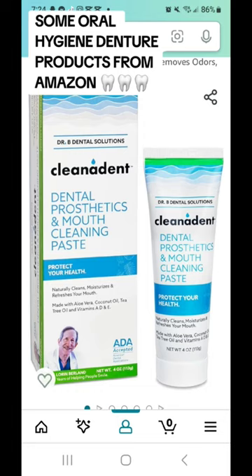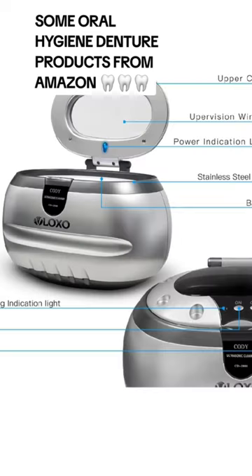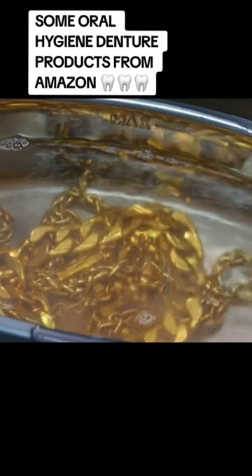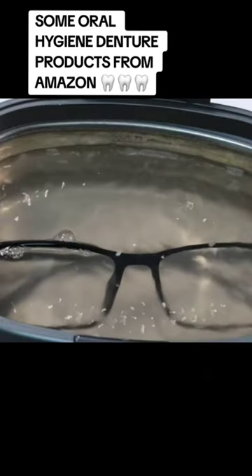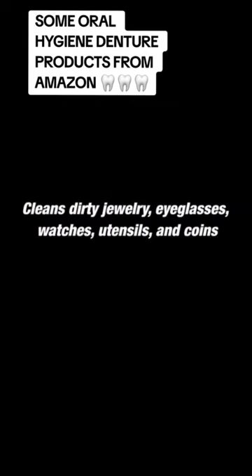My denture spa bath that I normally used to wash my dentures no longer works, so I repurchased this little guy right here, which is a lot bigger and wider. She's also multi-purpose — for watches, jewelry, your dentures, all that good jazz.